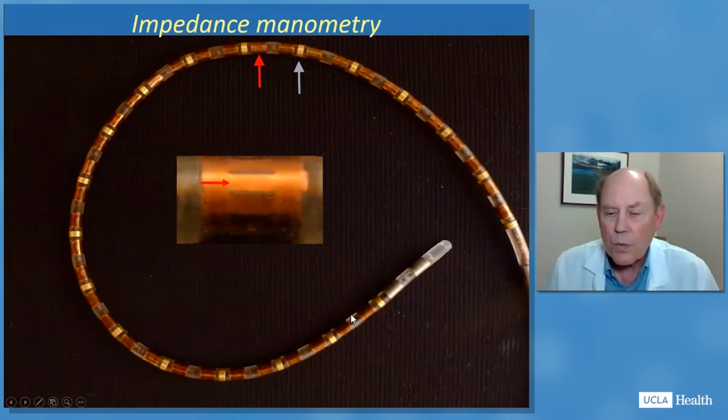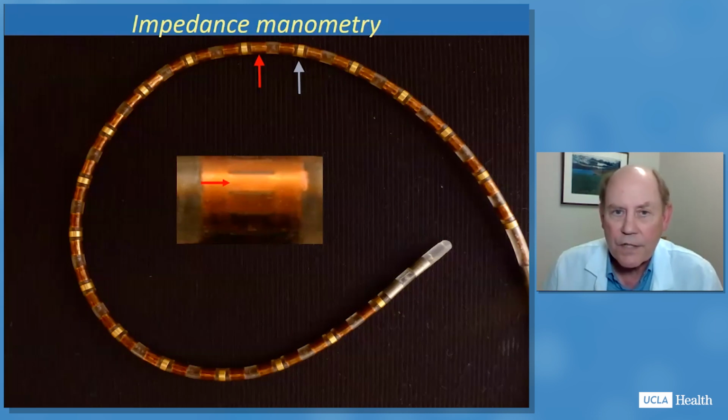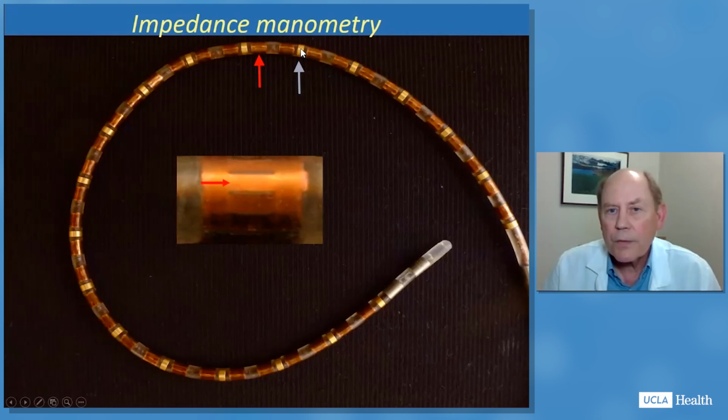It's long enough to span from the stomach to the pharynx, so through both the lower and upper esophageal sphincters. The gold-colored rings are the impedance electrodes. And you can see that they're also spaced along the length of the catheter.